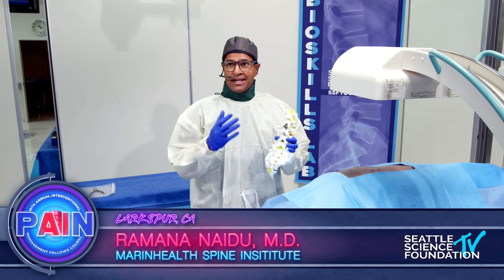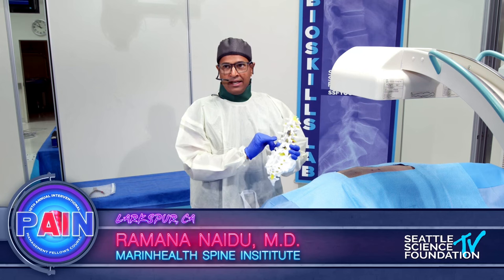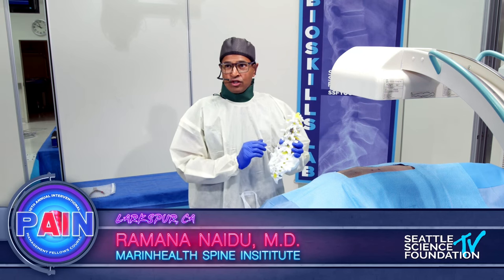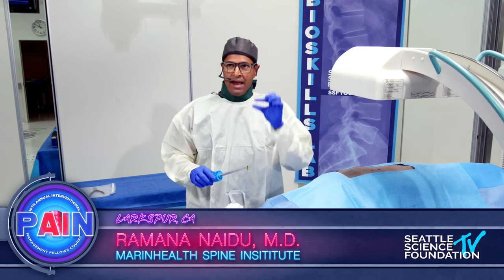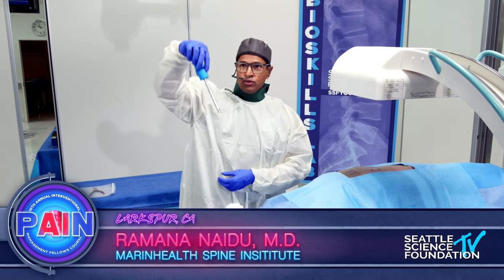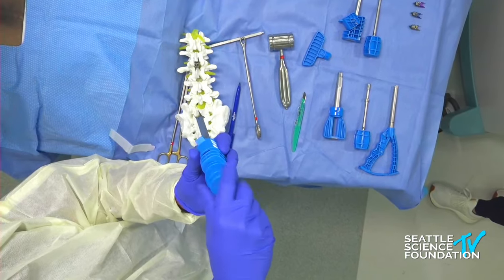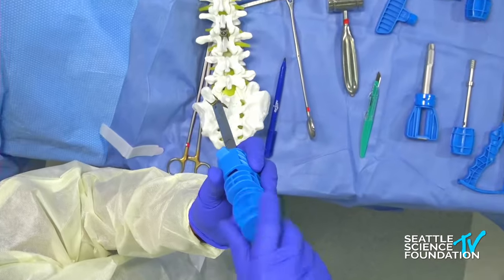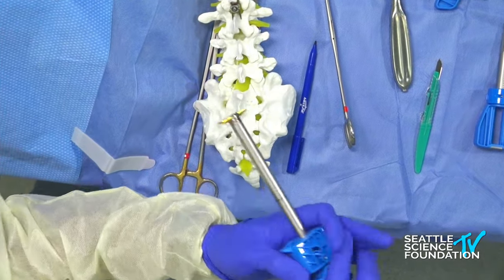As you can see, it's basically a titanium H in the interspinous space. What's beautiful about the procedure is you can do it through a half-inch incision. It goes enclosed — if we can zoom in on this — and then what I do is I simply open it, and that's what's deploying in the interspinous space. I'm going to show you that in the cadaver.